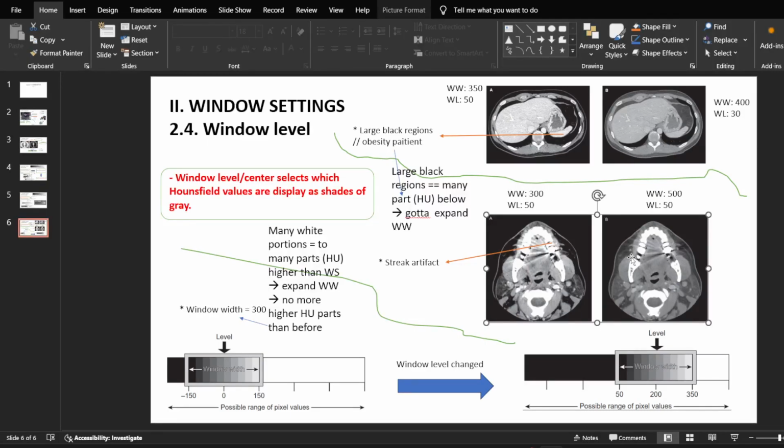But usually you first modify some window settings to get the best image you can to send to the doctor. It's kind of easy, and we don't need to stress about it. Just follow instinct, because over time, gradually, you will know what the best image is. You will know when the time comes. You just drag your mouse, drag your pointer, and you will feel what the best image is that the raw data can give you.